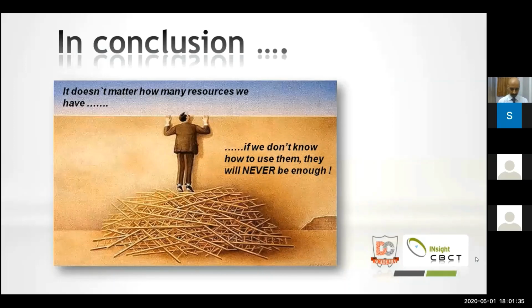I'm sure this will add a lot to the way you practice implant dentistry, and it'll give you one more tool in your hand to perform your work with much less stress, in teeth-driven or occlusally driven implant placements.